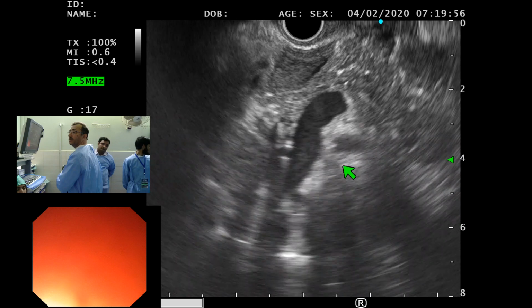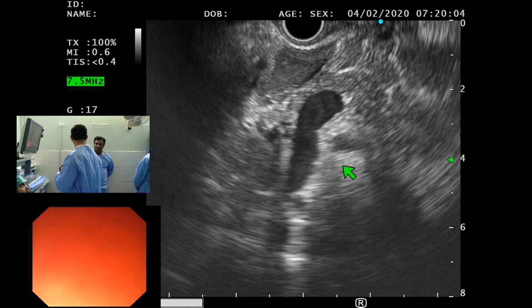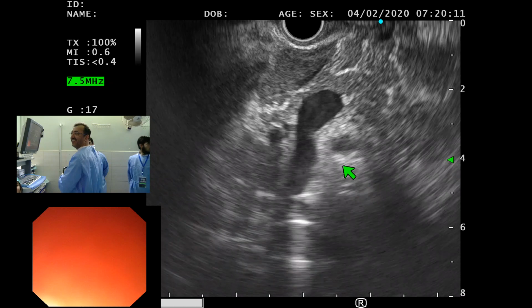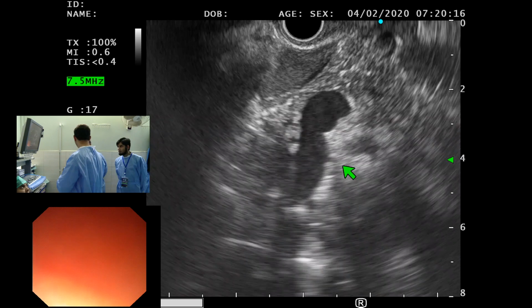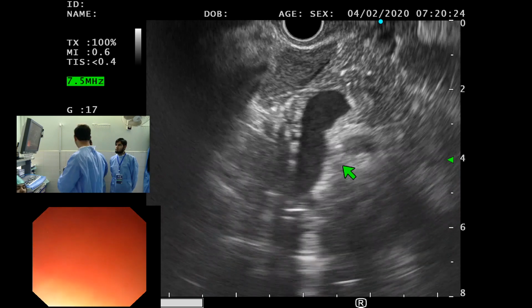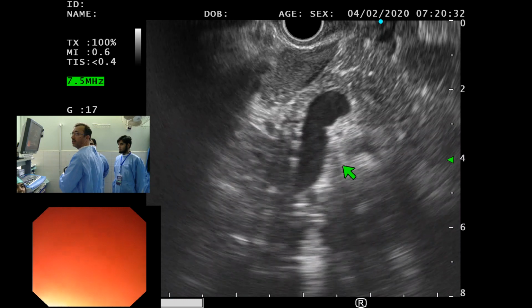Any question from the audience on this case? Switch off कर दो। केस ऑफ था, टेंशन ना लो। क्योंकि इसने मुश्किल से वो स्ट्रेंथ को नीचे मैं लेके आऊँ, all the way down. और ये वाइड एब्नॉर्मैलिटी मुझे मिली थी. Pancreatic duct is prominent, I agree, but again nothing unusual, nothing abnormal except for this benign looking lymph node which is large. All other things are normal.